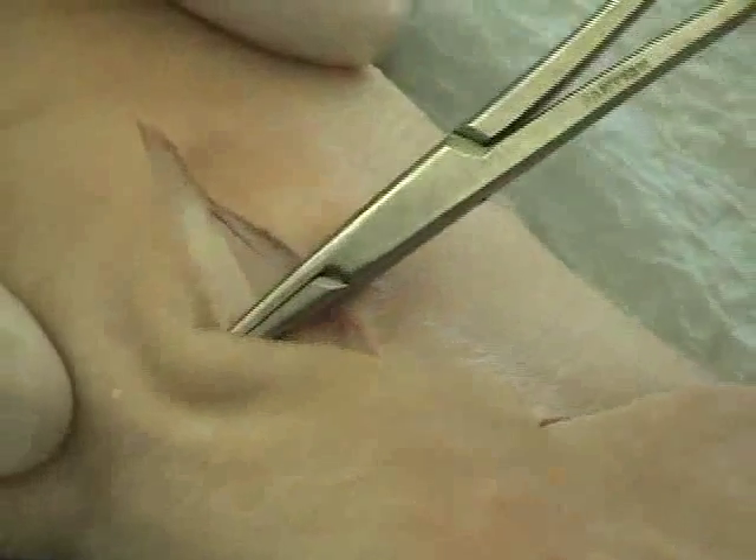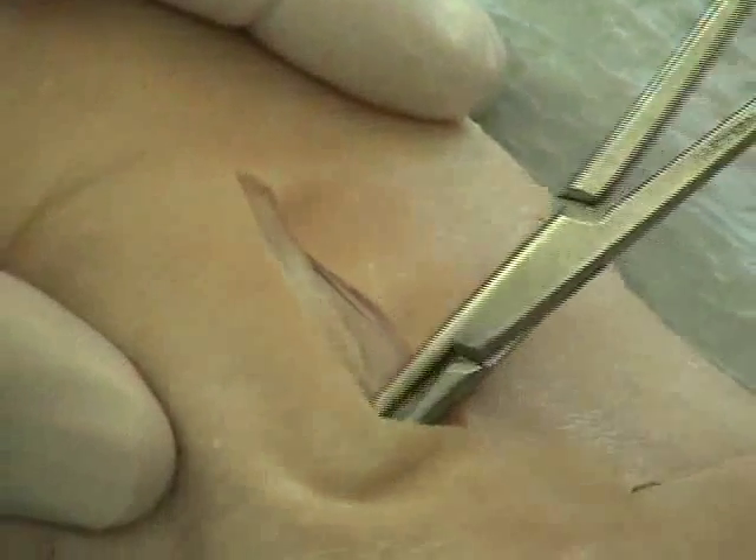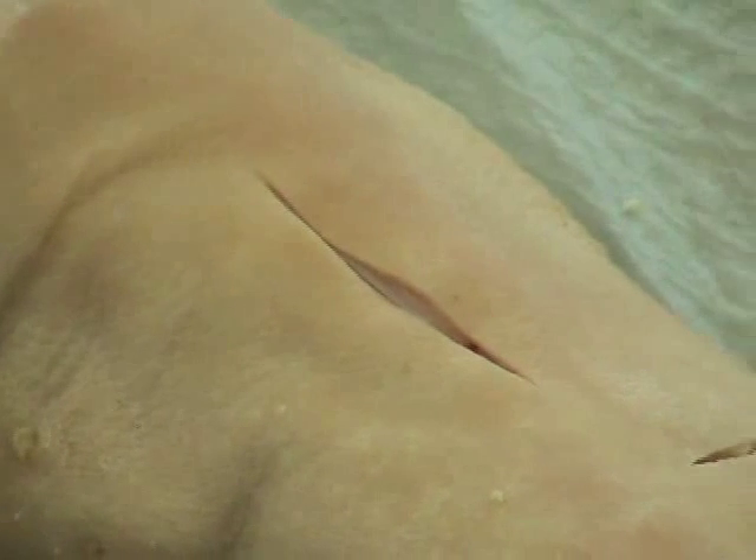This stitch is not very strong and should not be done in an area of high tension unless you're very careful to protect the area with steristrips or tegaderm to give support to the actual tissue. Since it is a running stitch, we typically start at one end. If you're right-handed, you hold the needle holder in your right hand and work from the left side to the right side.